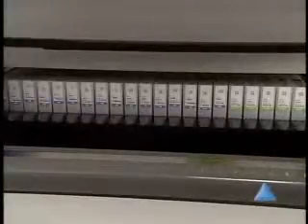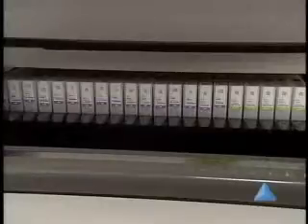If you are using only one or two types of reagents, you can load the pack starting at the appropriate location and fill the primary reagent compartment. To load the primary reagent packs, use the following procedure.